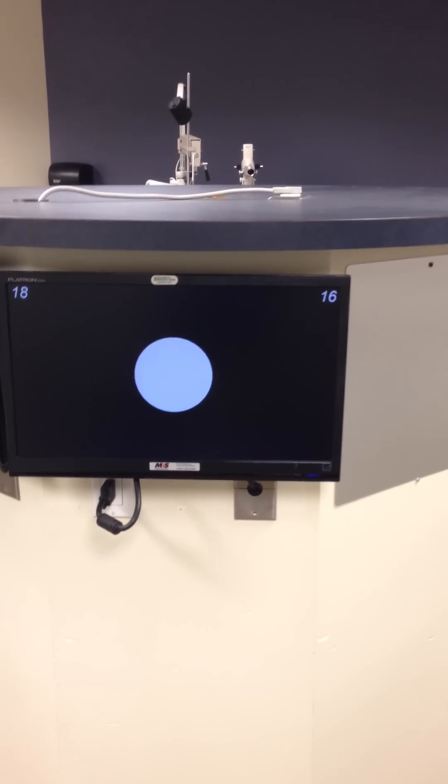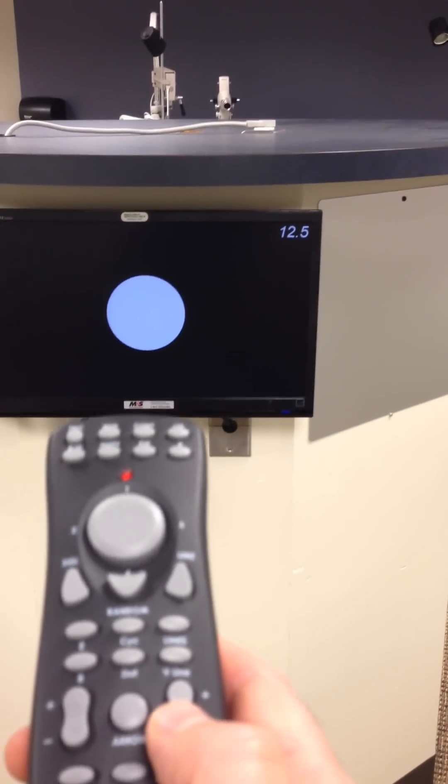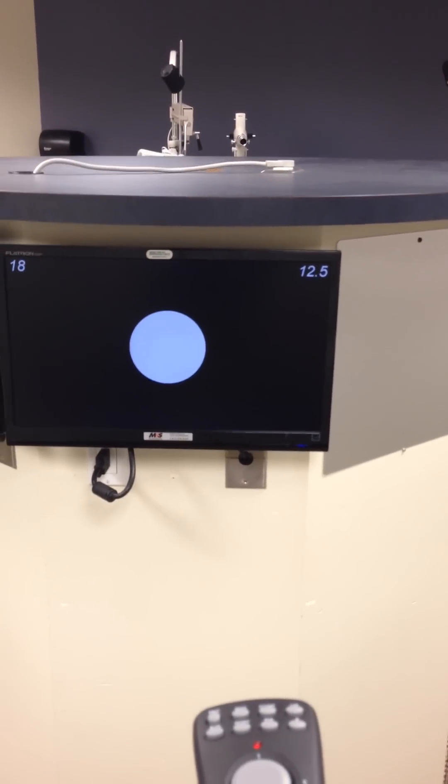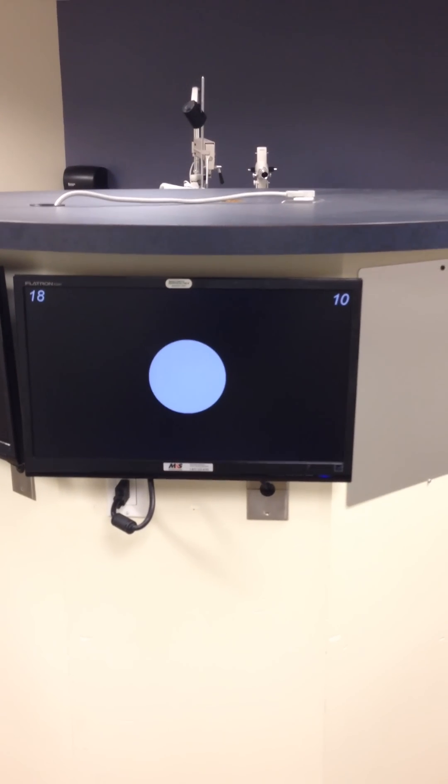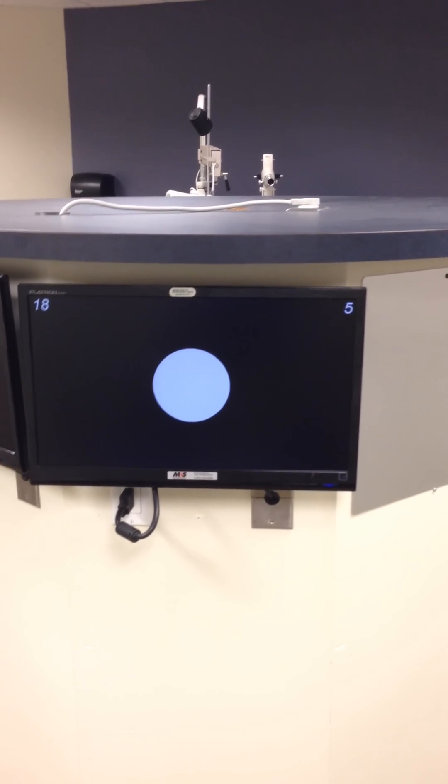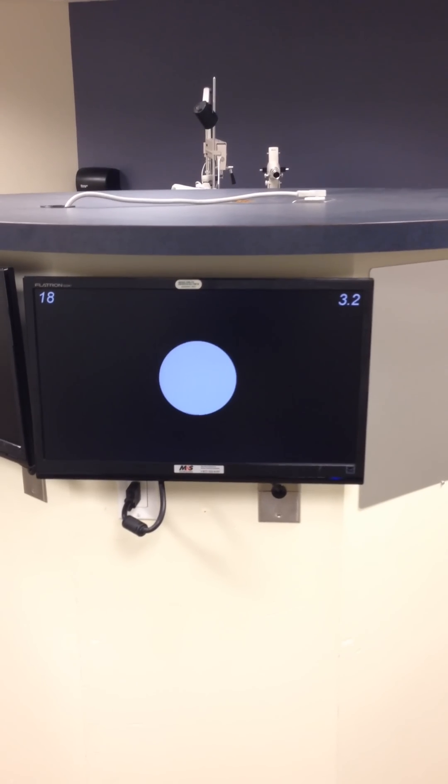Now, if you want to change the contrast, use the other button on your remote, this one. And now you can see we're at 12.5% contrast. I need to point back at the box here, rather than at the screen. 10% contrast on down, and that's percentage contrast in the upper right.